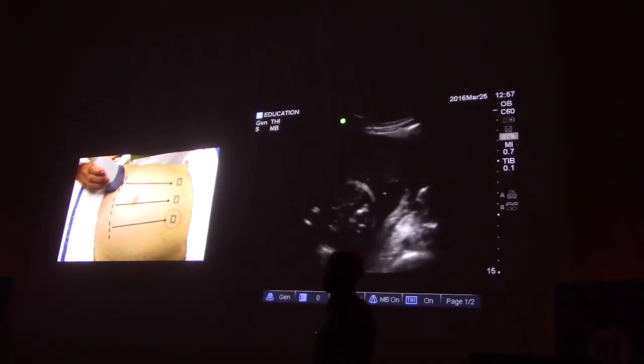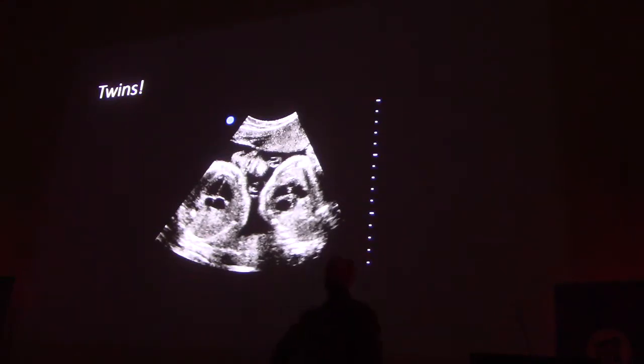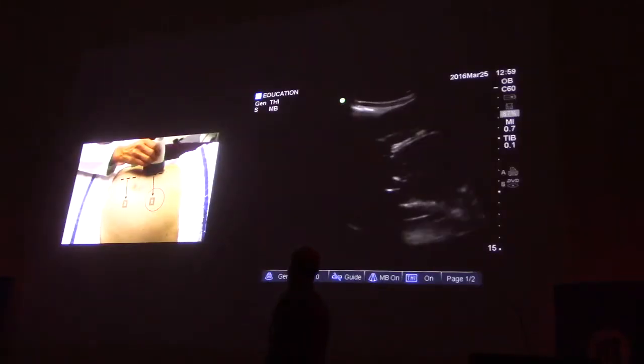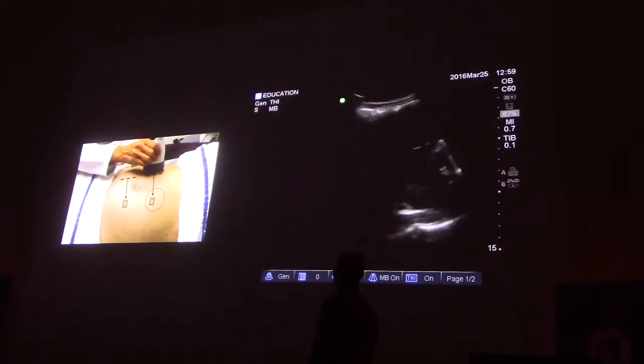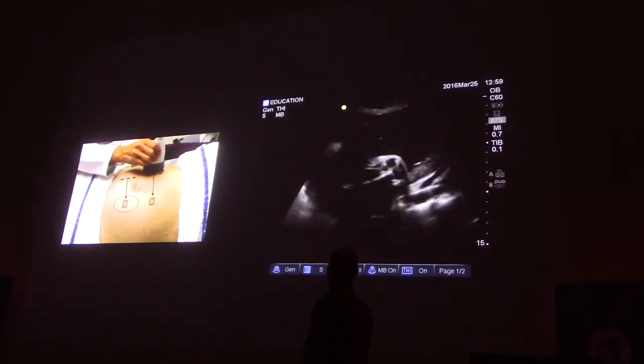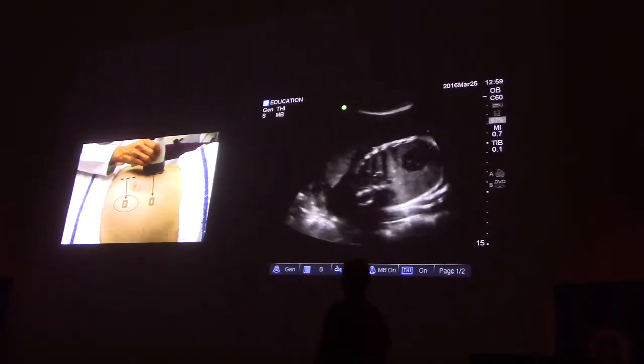pregnancies. If you think you have twin gestation, the gold standard, and especially for something that you want to submit to QA or let somebody reviewing your ultrasounds who's not physically there with you see, is to find two hearts, preferably get a clip of both of them beating at the same time. This is just a little bit more in sagittal view, sweeping transversely across. As we go through, we find one heart every time.